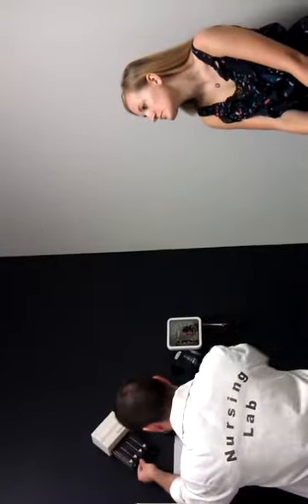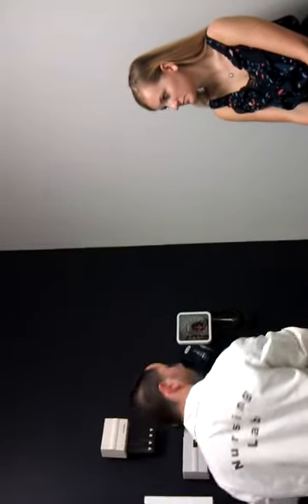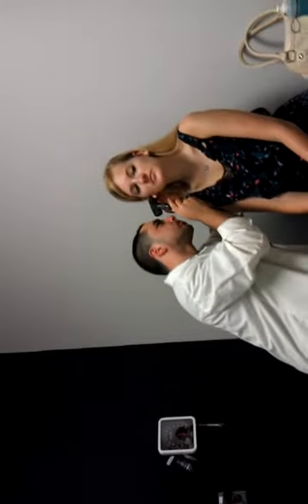Okay. Next, I'll be inspecting the internal canal along with the tympanic membrane. Bilaterally assessed.